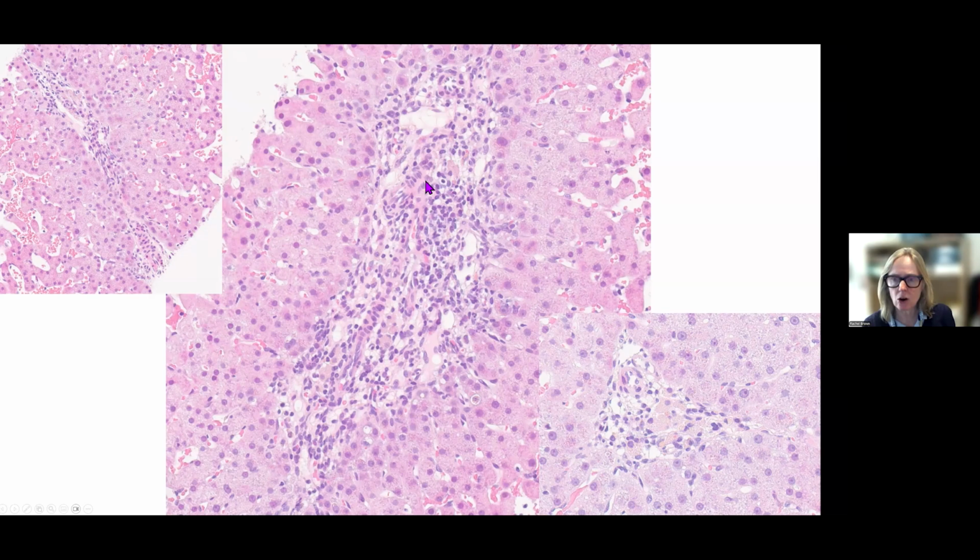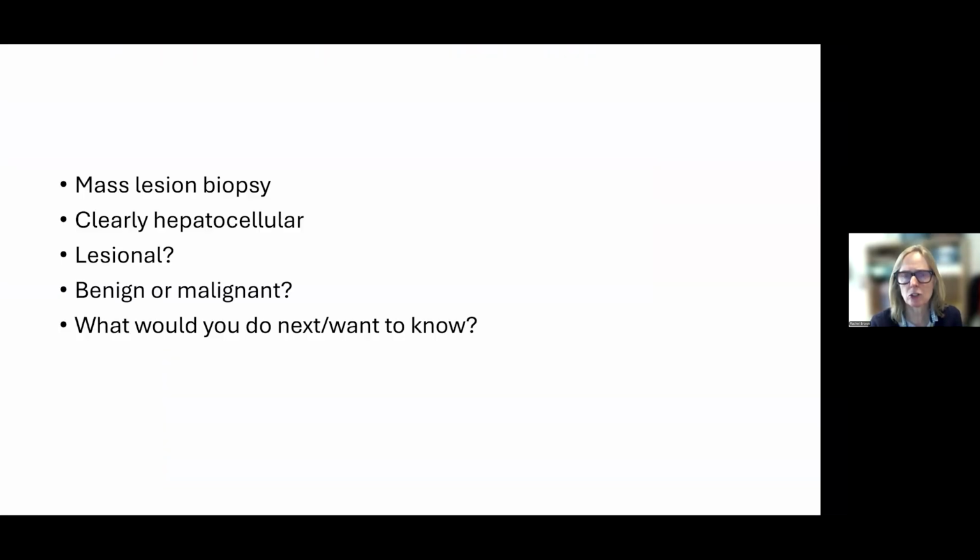This one has an artery coursing north to south across it, longitudinally sampled. There are a few inflammatory cells here in this structure, not obviously any biliary epithelium. And then this one, again, a prominent artery without an obvious duct. A few more of those foamy macrophages. So just have a think about what you think those are.